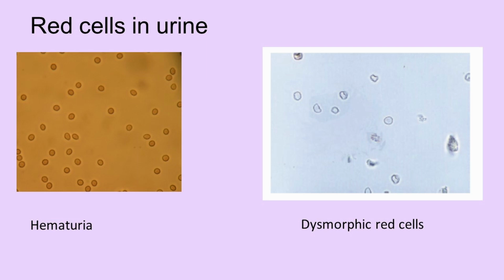Blood present in urine as intact red blood cells is called hematuria, and these red blood cells appear as smooth, non-nucleated biconcave discs measuring approximately 7 micrometers in diameter. Some of the major causes for hematuria include renal calculi, glomerular diseases, tumors, trauma, pyelonephritis and anticoagulant therapy.